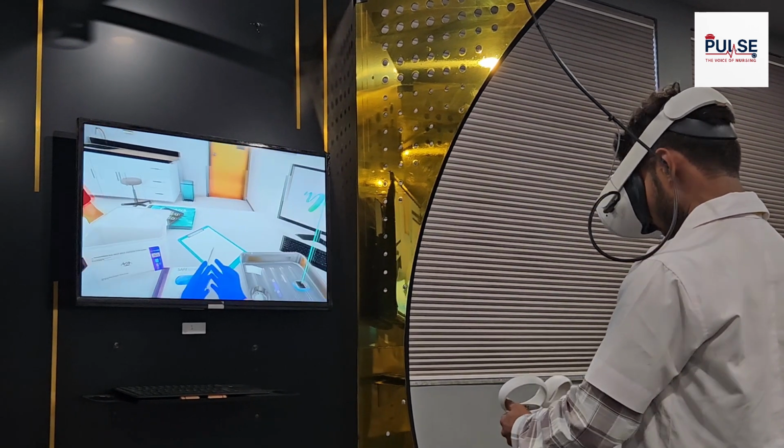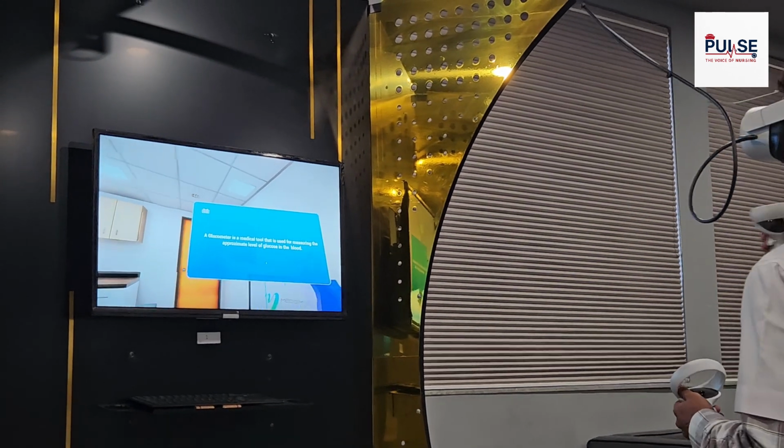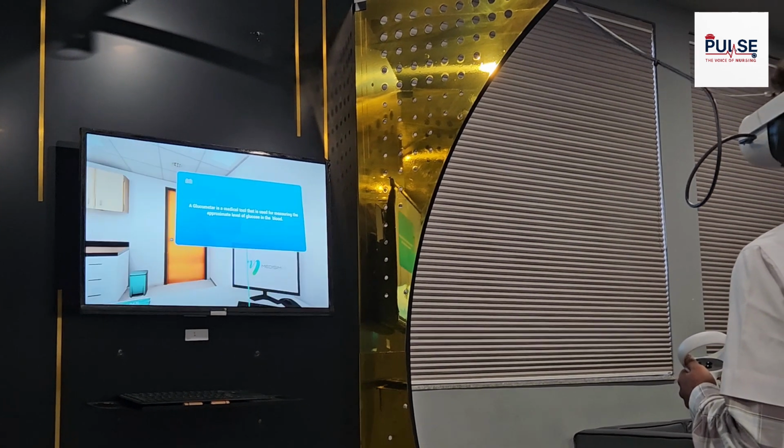Now we are going to learn about the glucometer. Tap on the button. A glucometer is a medical tool that is used for measuring the approximate level of glucose in the blood.